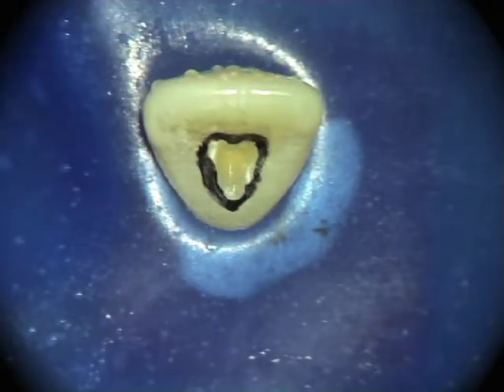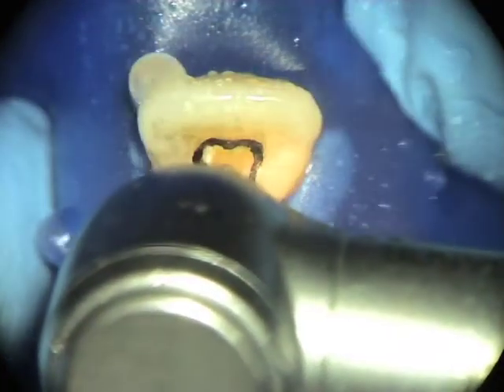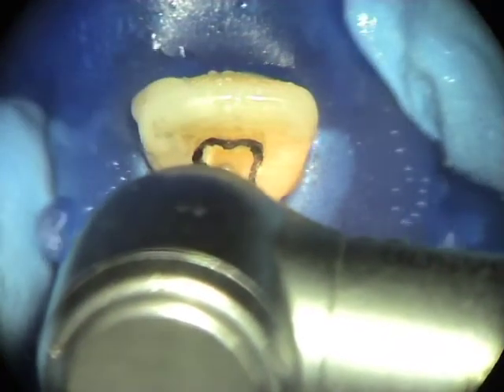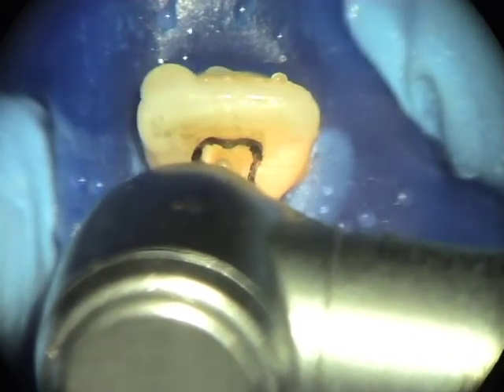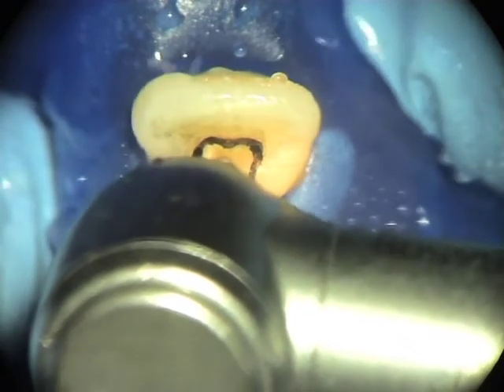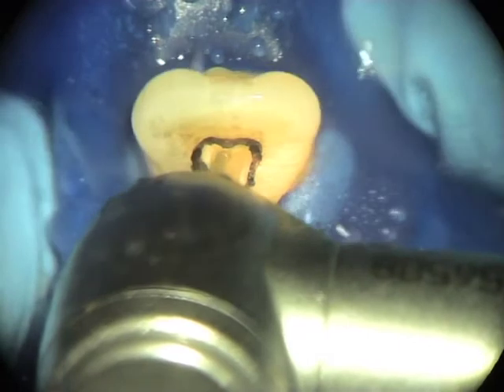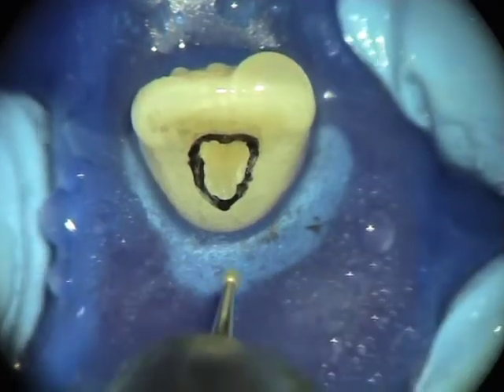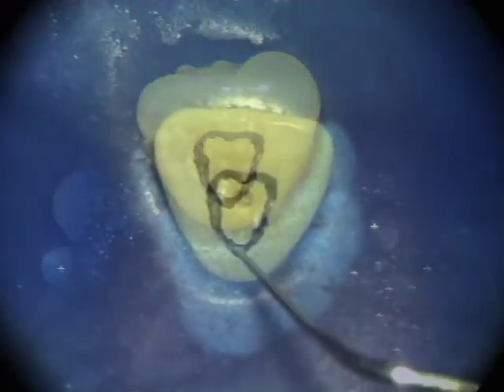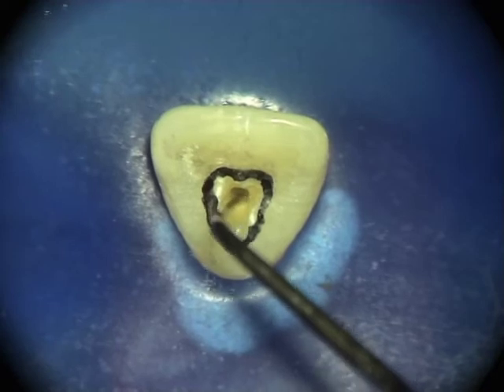Stop frequently to check progress. The entry to the pulp chamber can now be discerned.